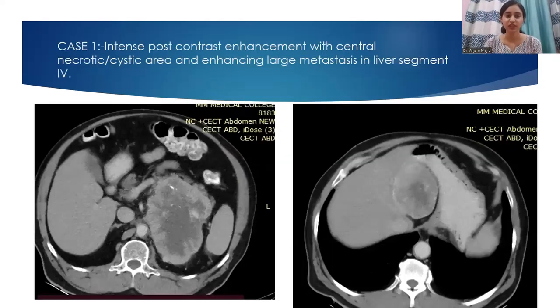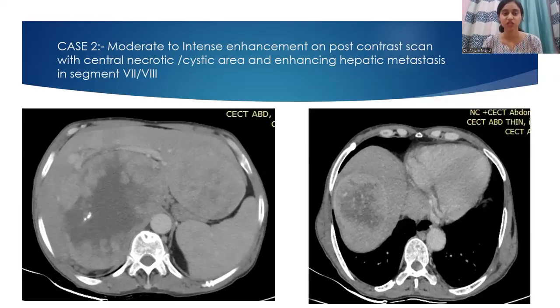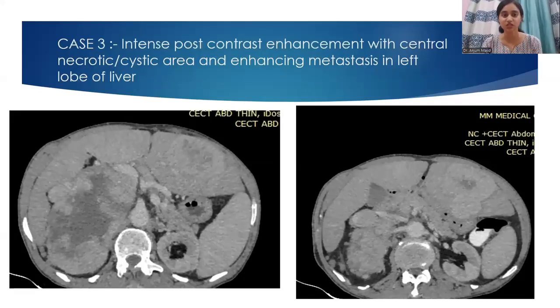Case 1 shows intense post-contrast enhancement with central necrotic cystic areas and enhancing large metastasis in liver segment 4. Case 2 shows moderate to intense enhancement on post-contrast scan with central necrotic cystic areas and enhancing hepatic metastasis in segments 7 and 8. Case 3 shows intense post-contrast enhancement with central necrotic cystic areas and enhancing metastasis in the left lobe of the liver.